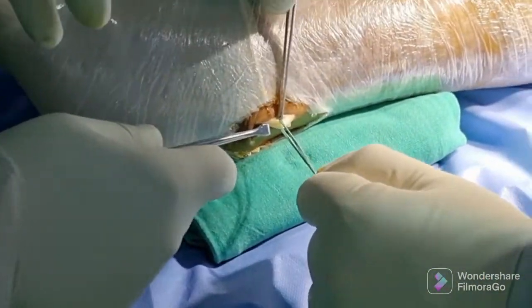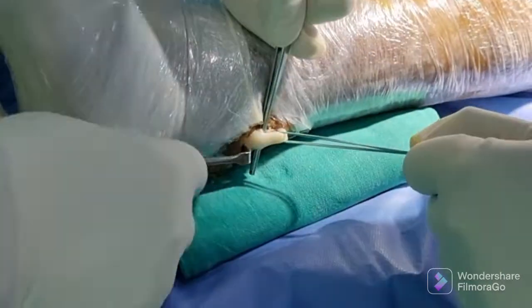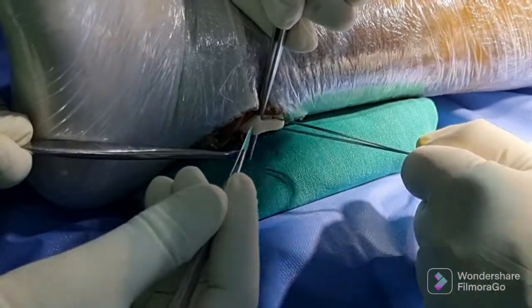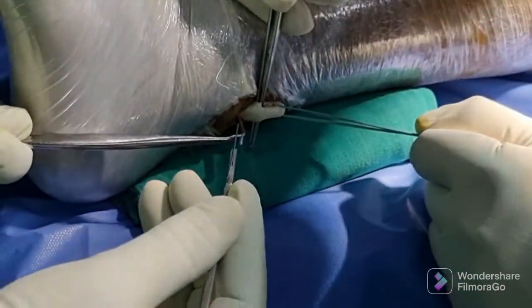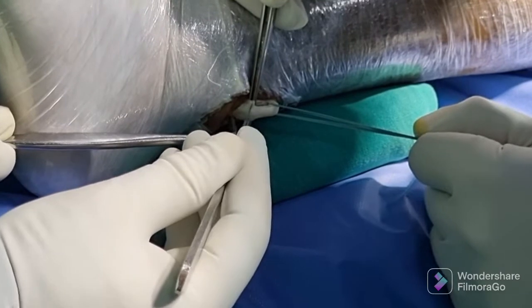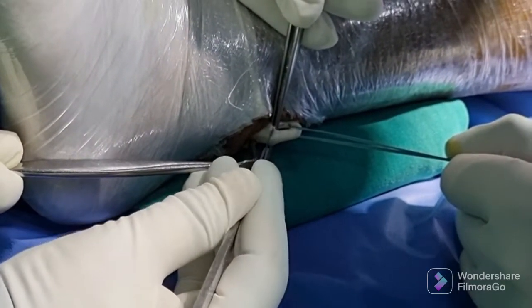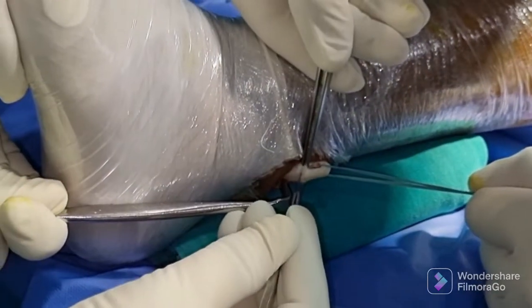Now evert the foot and deliver the maximum mass of the tendon outside the wound. Cut with a sharp knife through the furrow in the forceps the lower two-third part of the tendon.